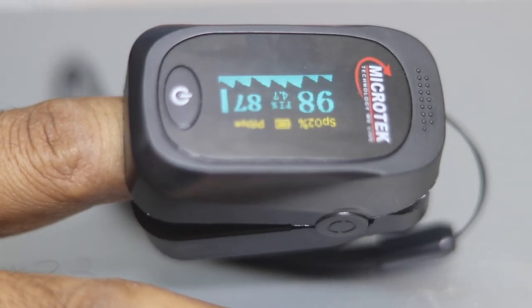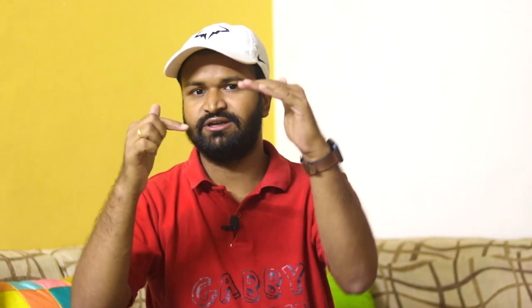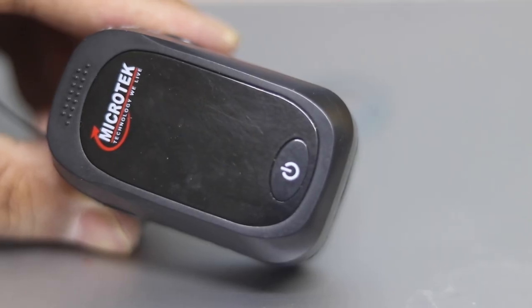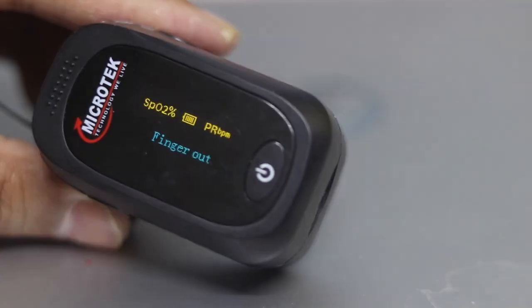When you use the oximeter, keep in mind that external factors can also change the reading. First, your nails should not have nail polish, because the light near the nail polish does not reach the detector and the reading will not be accurate. Second, when you check the oxygen, make sure your hands are not cold. Third, make sure your body is not moving, because if it is moving, the oxygen reading on your nails and cells can be compromised.